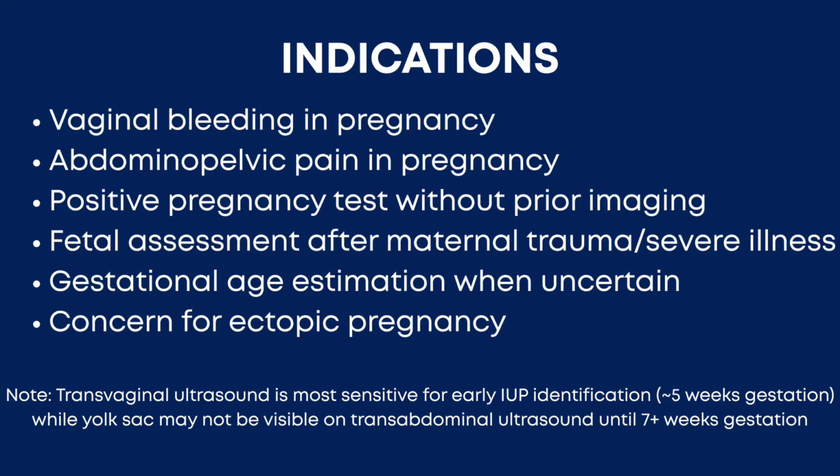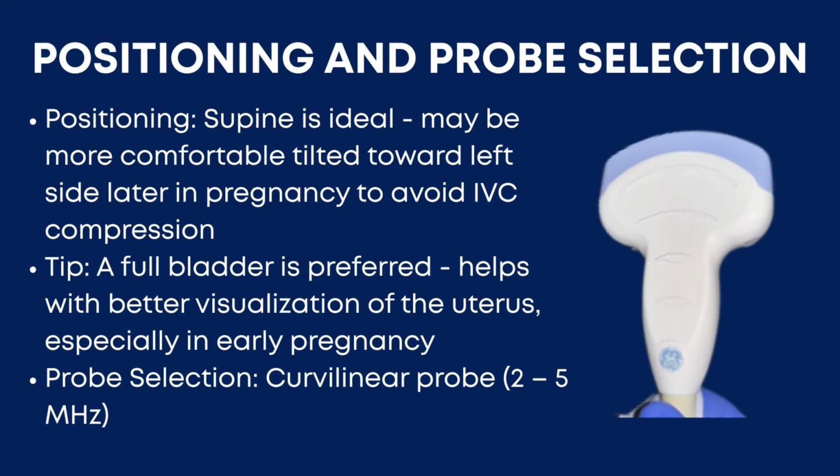estimations. It's also very useful for ectopic pregnancy, and if a patient presents with lower abdominal pain and unstable vital signs concerning for ruptured ectopic, it is useful for looking for free fluid in the pelvis, which can also help after trauma. So for positioning, being supine is ideal.